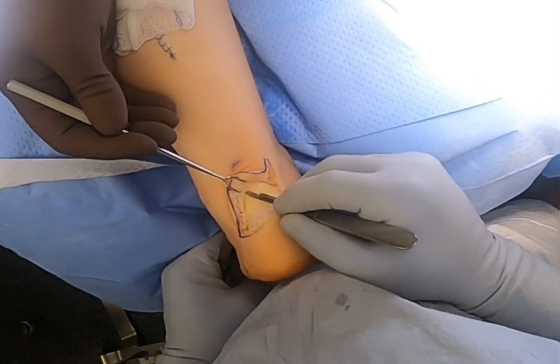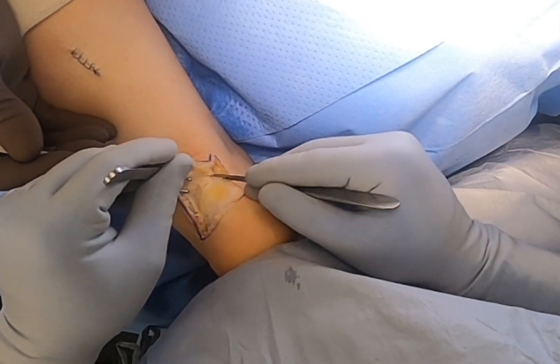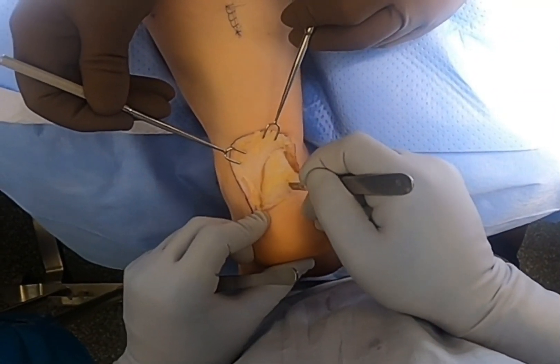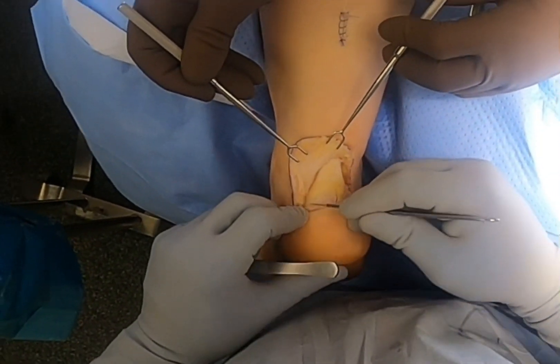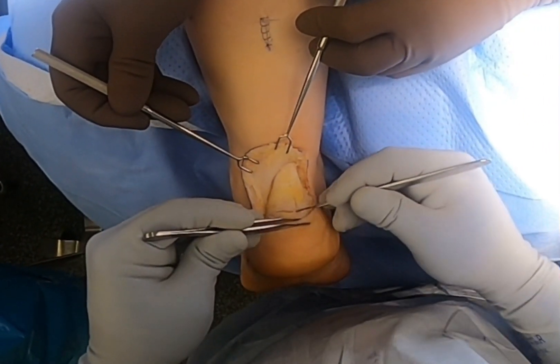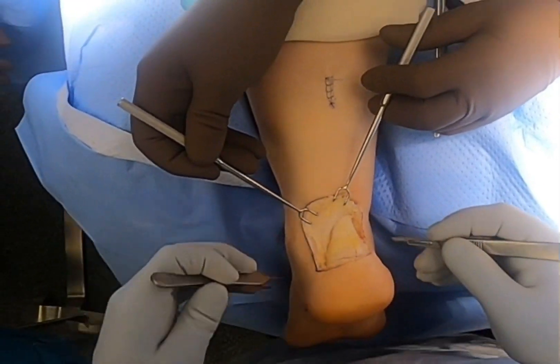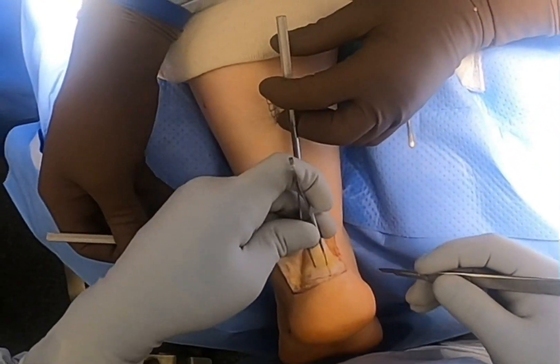Once I get it open, I have skin hooks retracting, and I visualize the Achilles tendon proper as it fans out medially and laterally. I make an inverted T-incision and butterfly the two areas of the Achilles tendon superiorly, exposing the posterior heel spur and the Haglund's deformity as well.